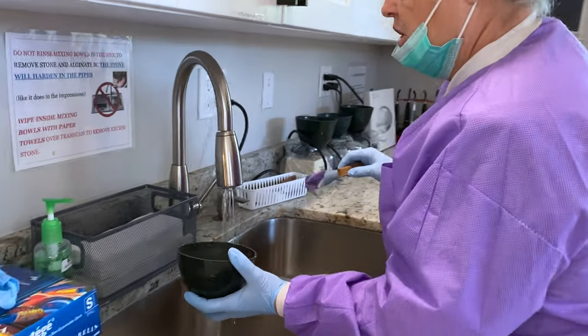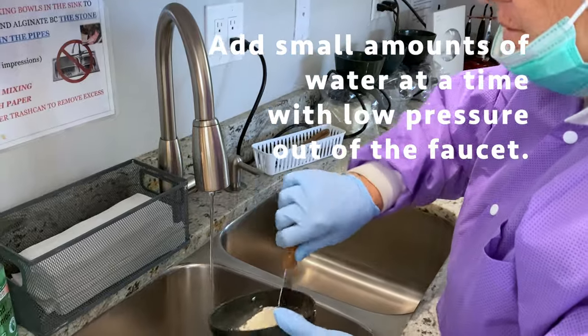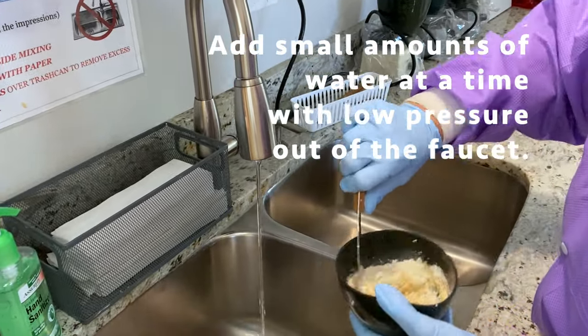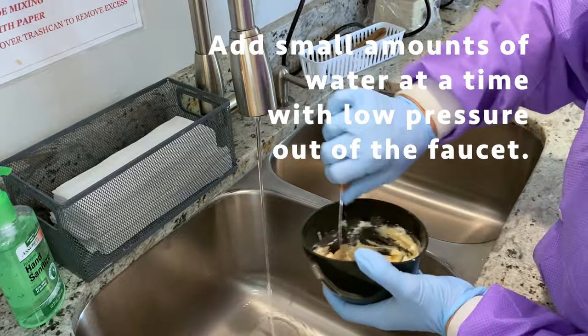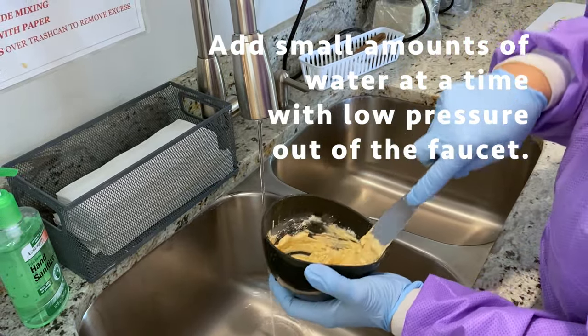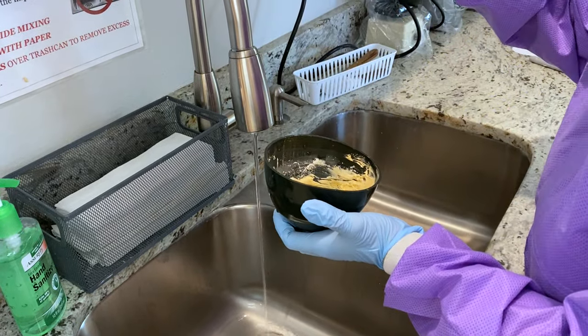What I do is I just go in, stir, go in slowly, come back out until I get that stone all incorporated where there's no powder. I like this thick mix — it doesn't fall from the spatula.